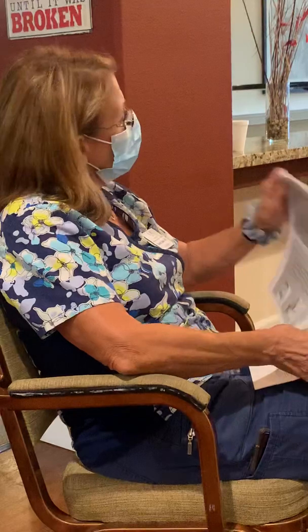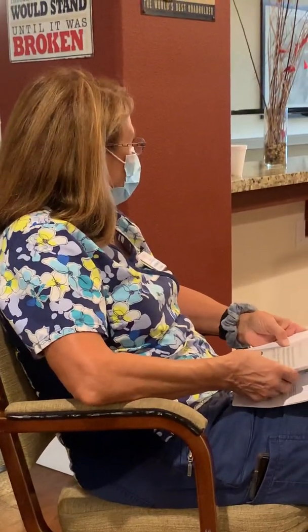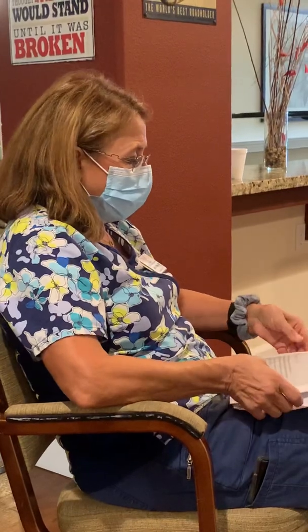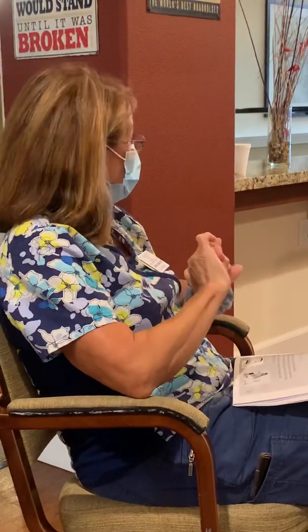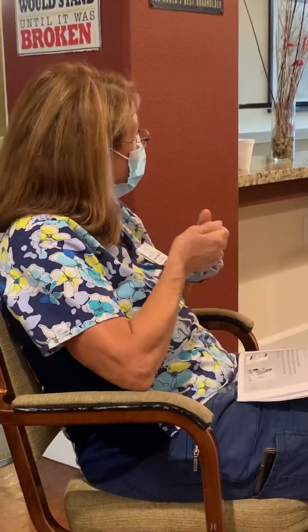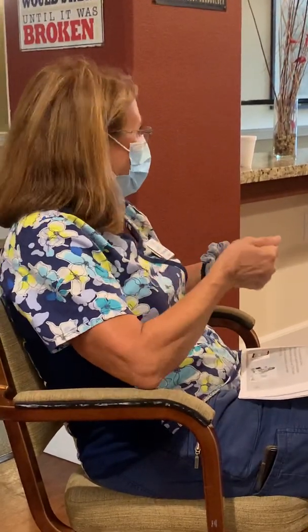You should conduct a Foley assessment at least once a day. Always go in there and check it out. Make sure that it isn't kinked, that there is good drainage in the tube. Is there any color change? Does the bag need emptying? Does it look like it's being pulled a lot on that urethra? So make sure all of those things when you go in and assess that patient, that it's not pulling and jerking on them.